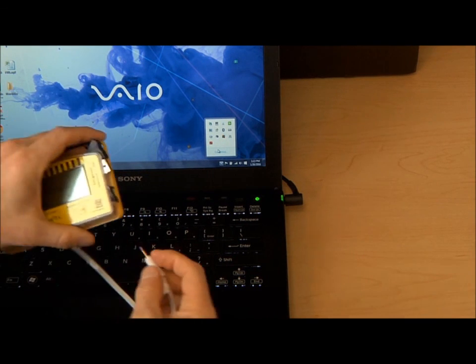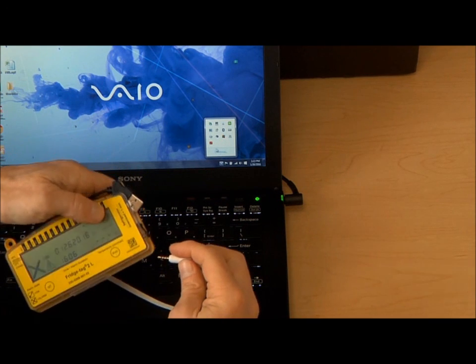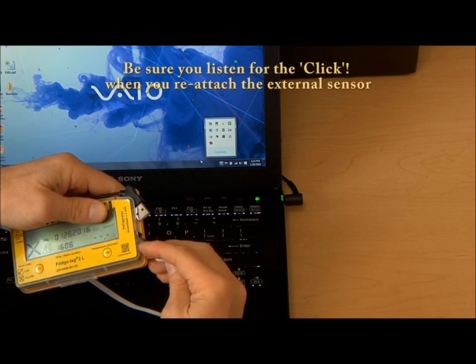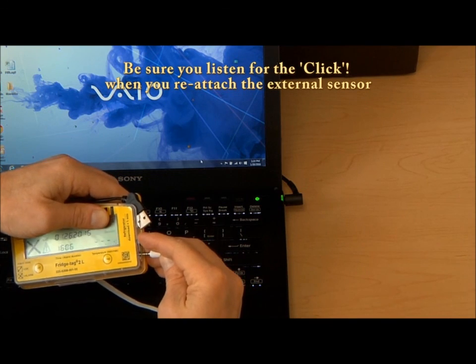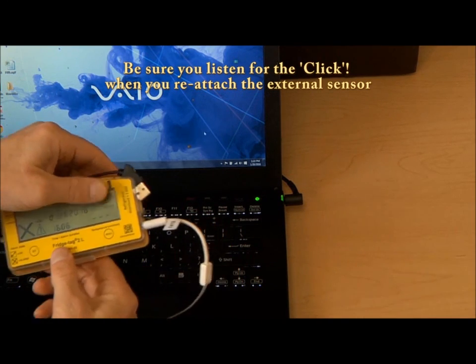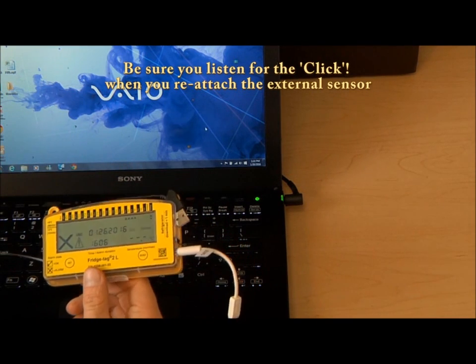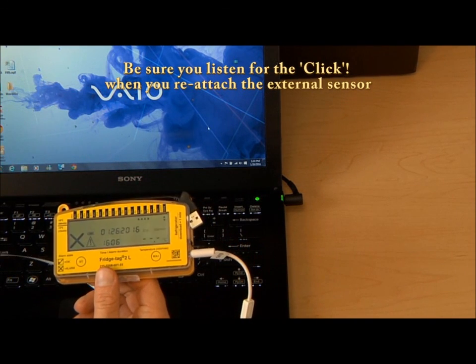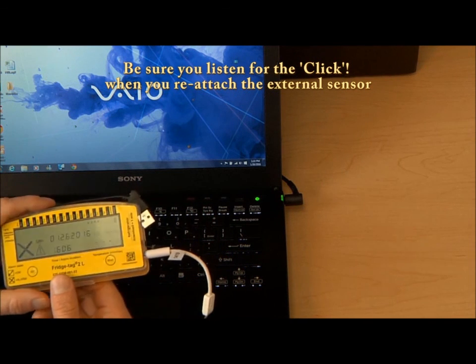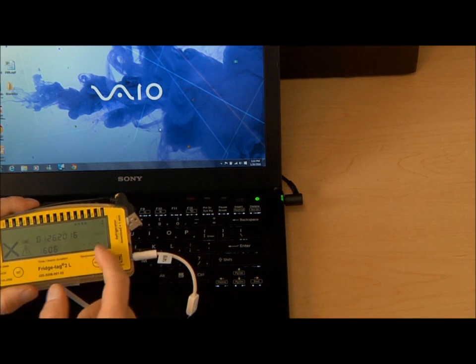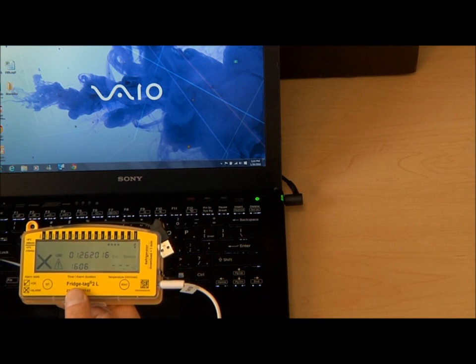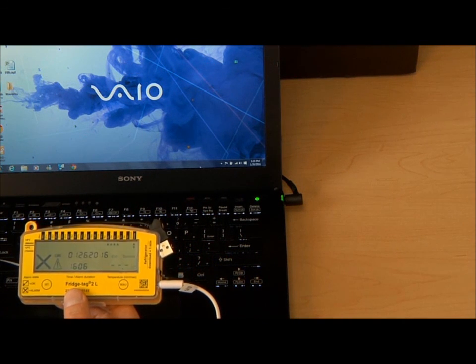Be certain when you do take it to the storage unit to listen for the click when you reattach the external sensor and wait a minute to view a current temperature on screen.